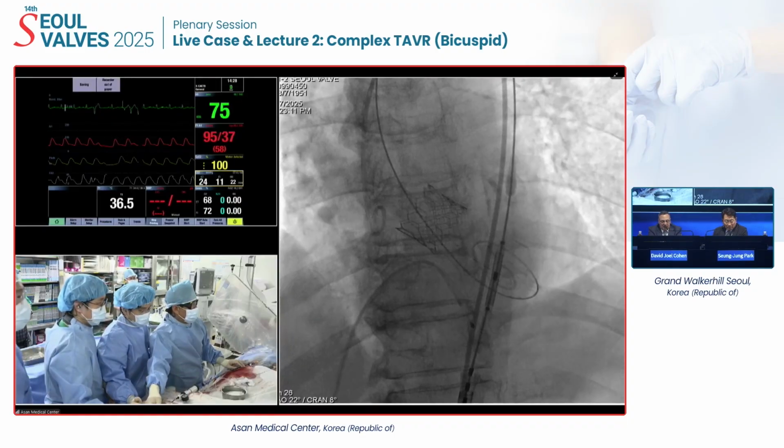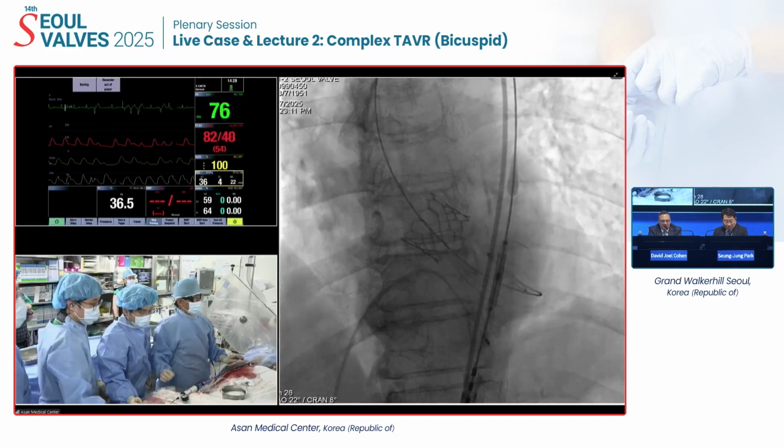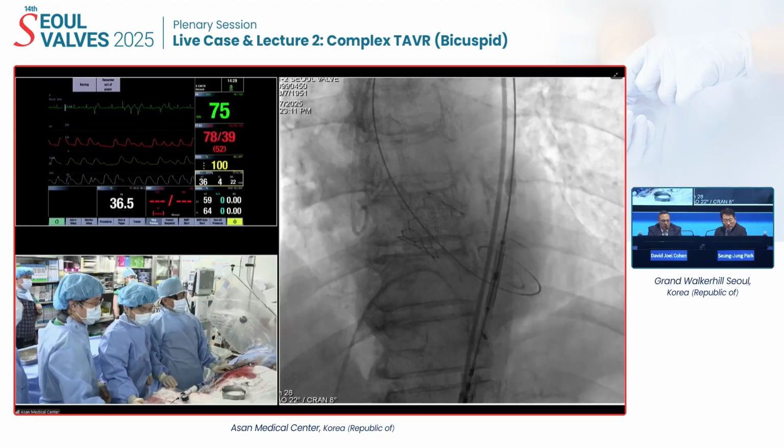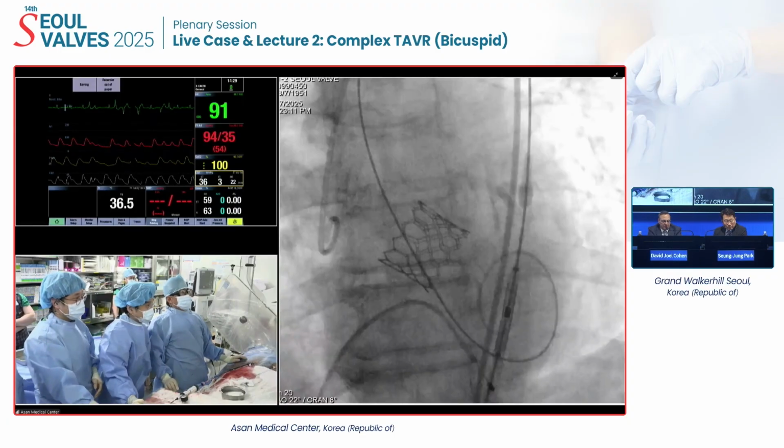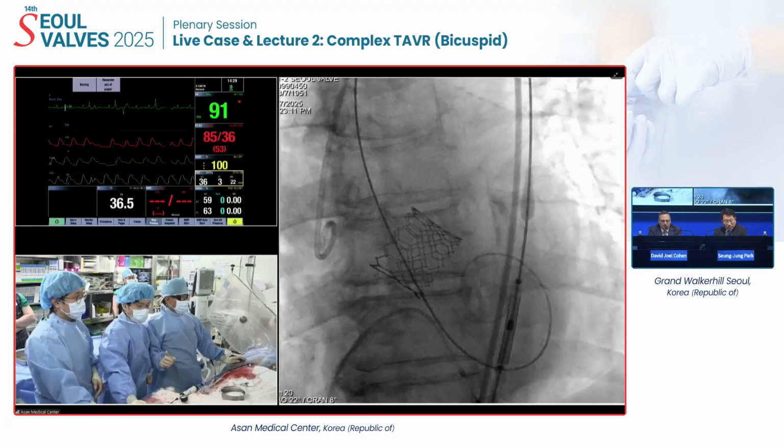Let's see how you did. We leave it a little bit. Okay, and that was Jung-Min. Was that plus one? Were you plus one on your volume there, or is it nominal? Plus one. Okay. Ready?